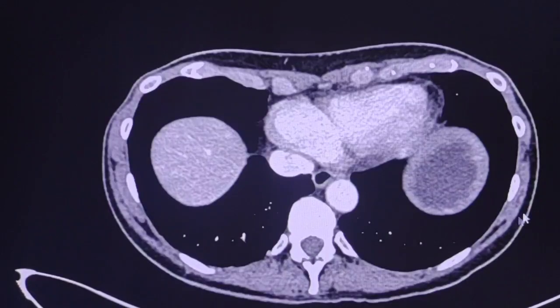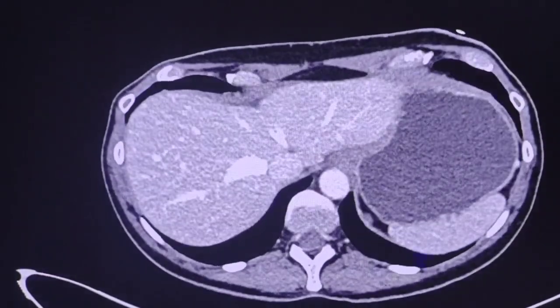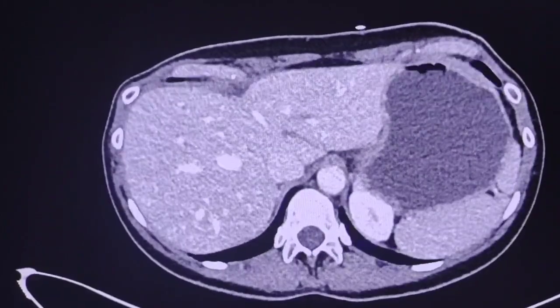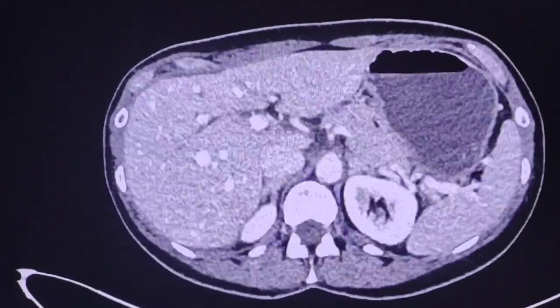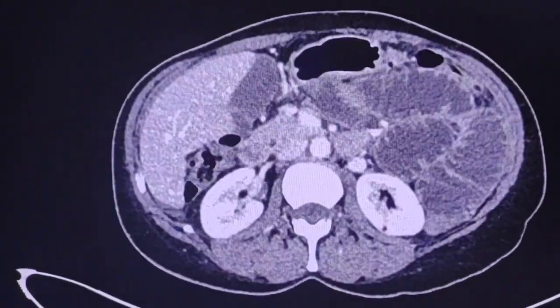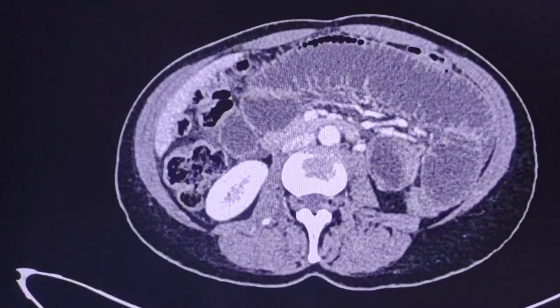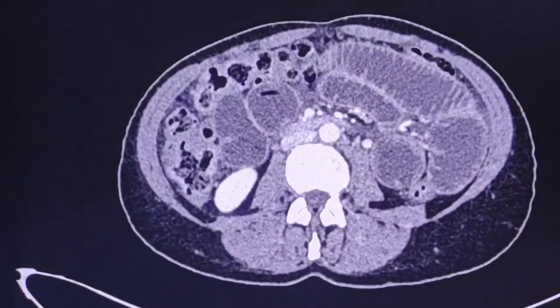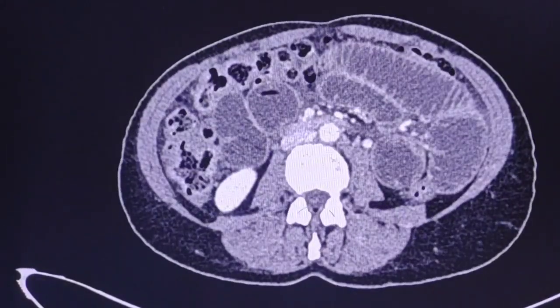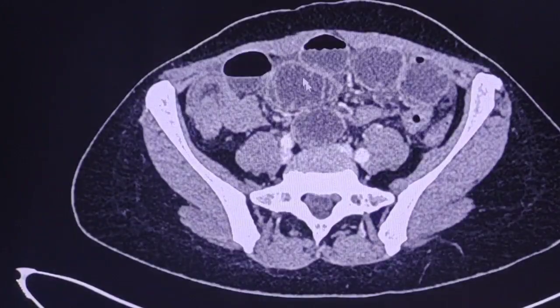Let's have a look in the transverse plane. We see significantly dilated small bowel loops with some air-fluid levels.